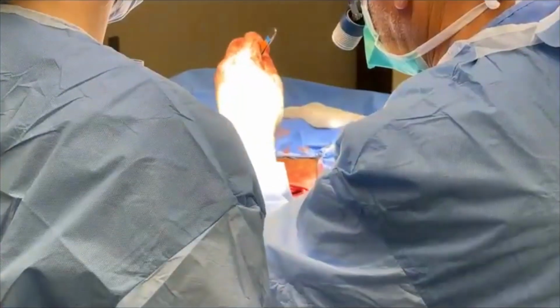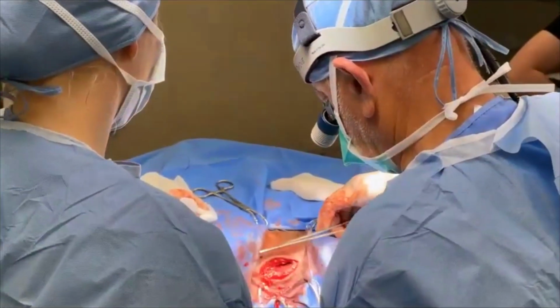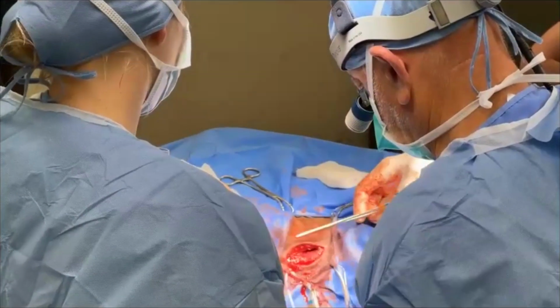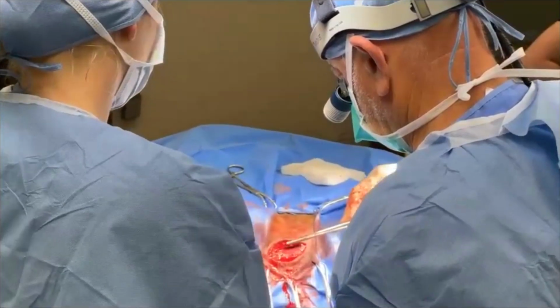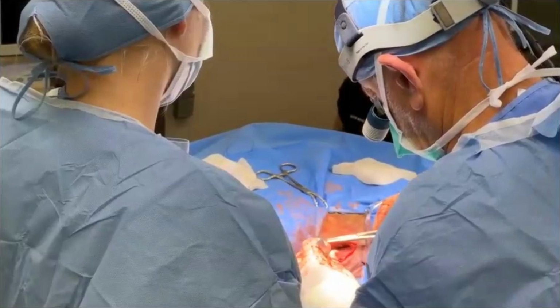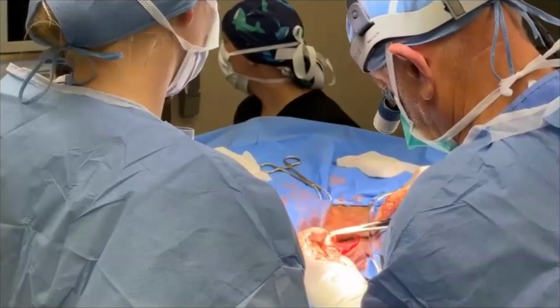Okay. And the thing that has helped me a lot over the last, I don't know, probably 7 or 8 years, is putting a suction drain in that site so I do not get all that fluid accumulation. It sucks it out. And I usually leave the suction drain in for a couple of days. Okay, so that's a temporary thing. Yeah, not everybody uses that. In fact, I don't know anybody else that uses that, but that has helped me a lot in preventing seromas at the surgery site. Okay, very good.